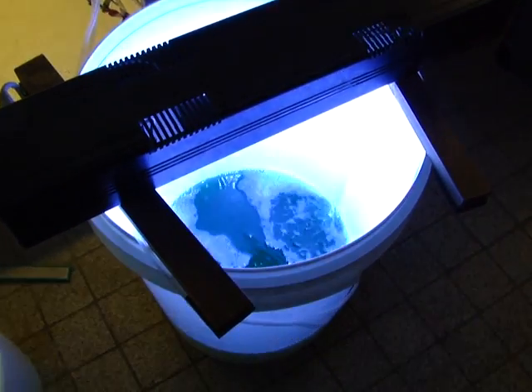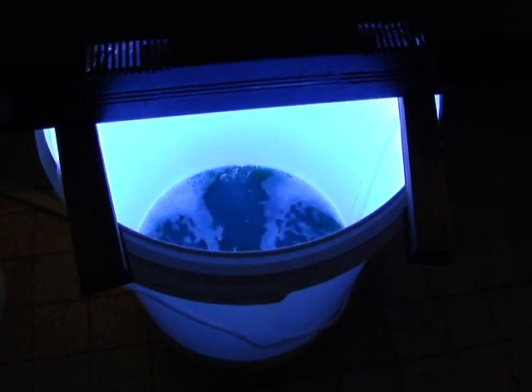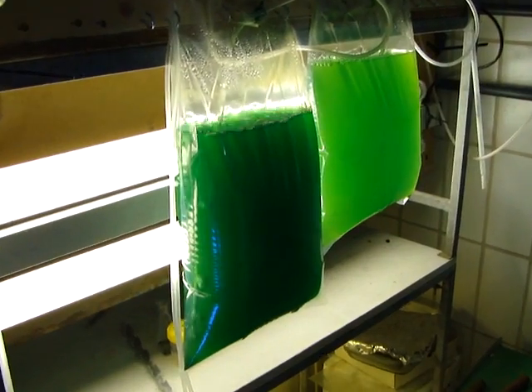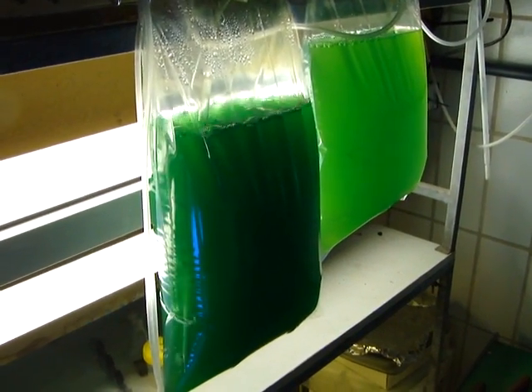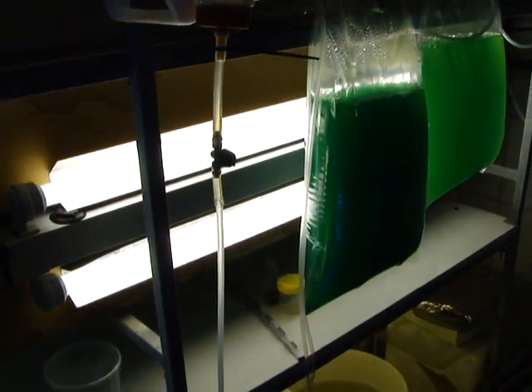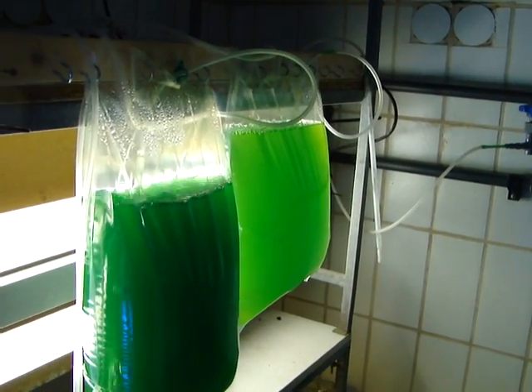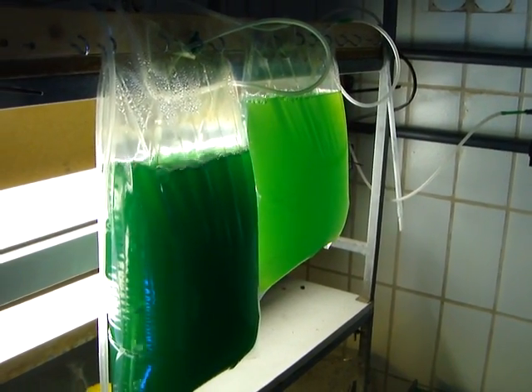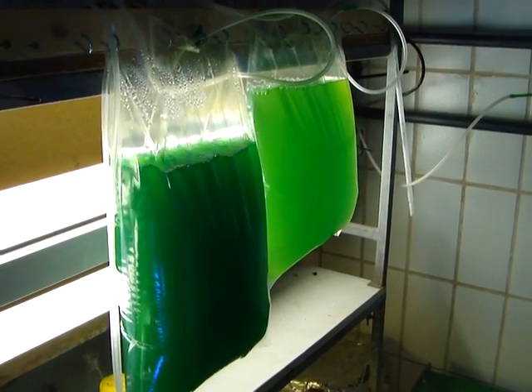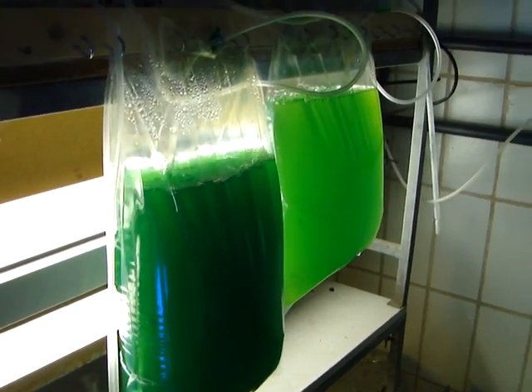And here we have Nanochloropsis. I started today the culture of Nanochloropsis from culturing these bags. We are using these bags for culturing Nanochloropsis and Phytoplankton. It's working really well because they grow really fast, and it's a really clean and aseptic method — it's difficult for them to get contaminated.